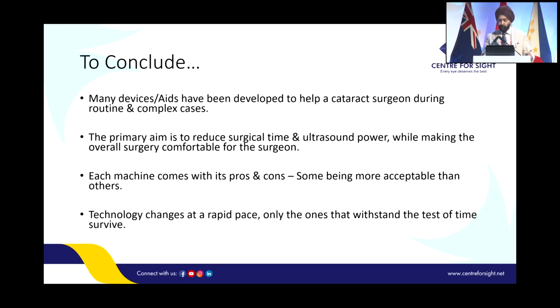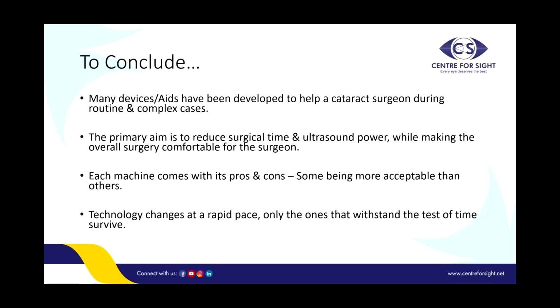So to conclude, there are several devices and aids which have come along with the femto. You use these devices and you are able to get excellent results. The only negative side is the costing for buying the machine and the per procedure cost. But I think patients are willing to pay, and if you can give them the guarantee of safety, you would be happier doing the procedure with femto laser assisted cataract surgery. Thank you very much for your kind attention. Thank you.